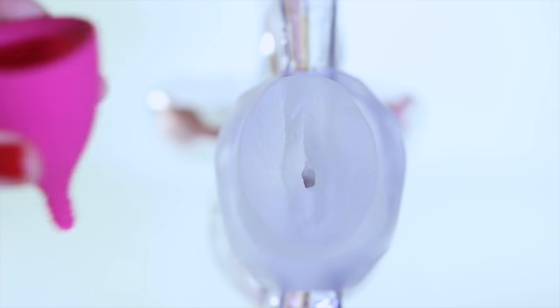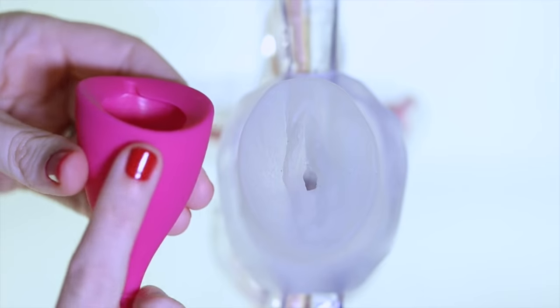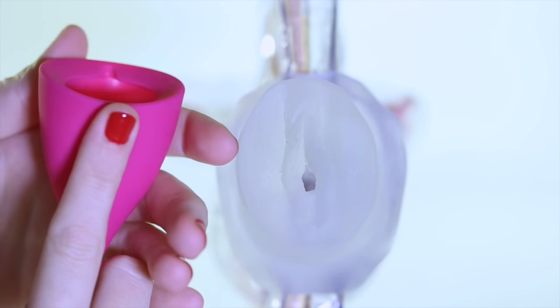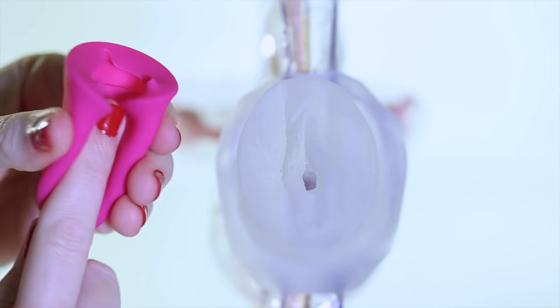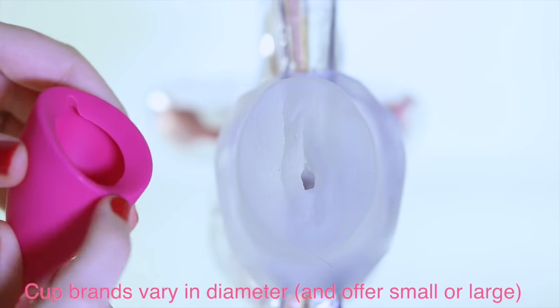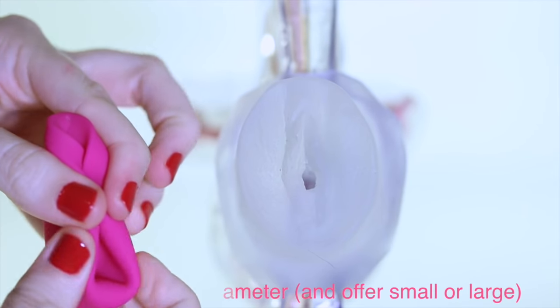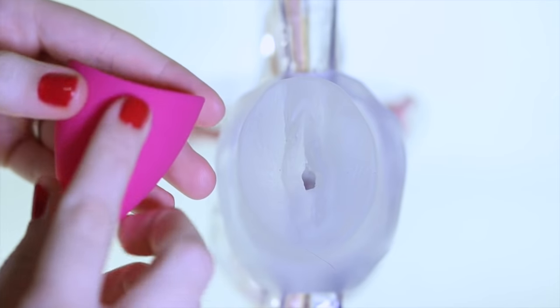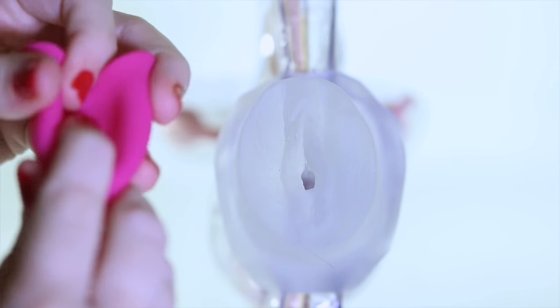Most people are intimidated because these cups look so large, but because you're going to be folding them it's not quite as big. It is probably still going to be a larger diameter on entry than a tampon, but not by too much. They definitely can fold down. This is the punch-down fold, and there are various folds — if one doesn't work, please try another.